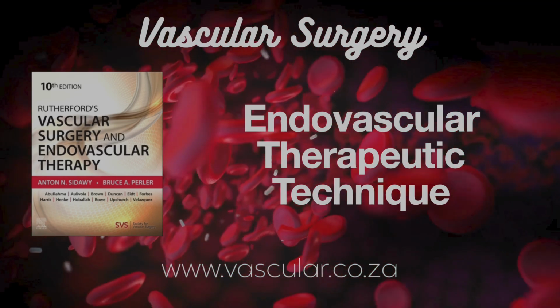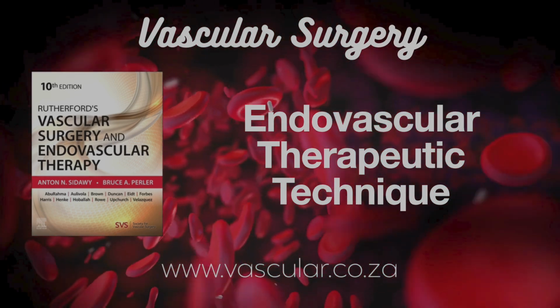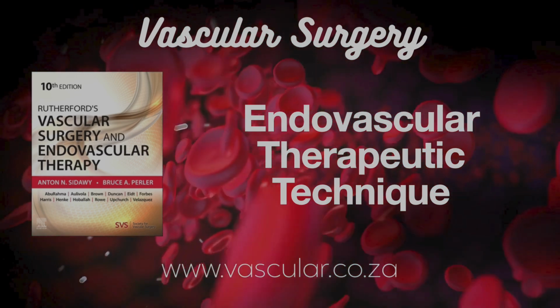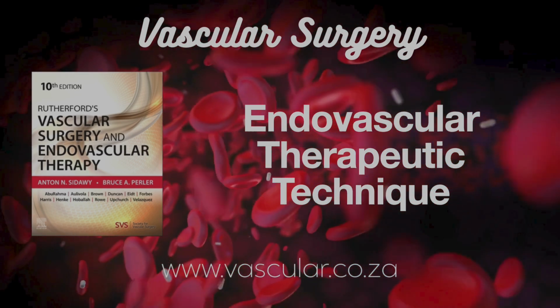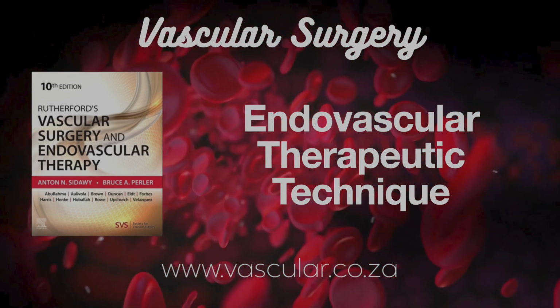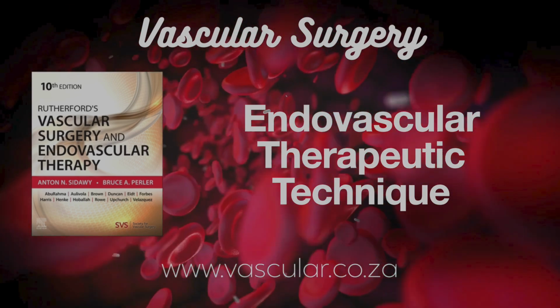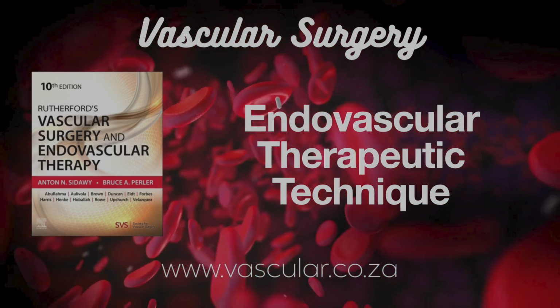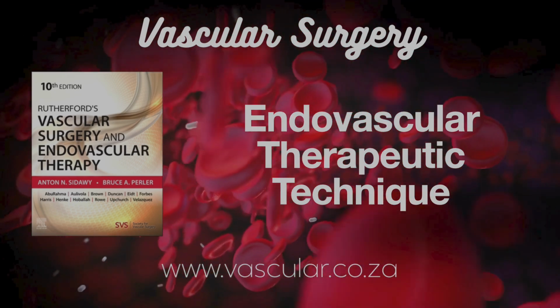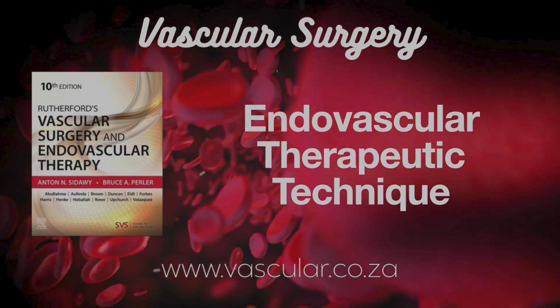But the source also mentions drug-coated balloons, DCBs. How do they fit in? Are they trying to avoid the stent? That's the idea. DCBs are a really innovative approach. They're designed to deliver medication directly onto the artery wall during that balloon inflation. What kind of medication? It's an anti-proliferative drug. The goal is to stop the smooth muscle cells from growing excessively, because that cell growth is a major reason arteries re-narrow after treatment. So it targets the healing response itself. Exactly. It's like a very localized, very targeted drug delivery system, aiming to reduce the need for that permanent metal scaffold. Interesting. Less foreign material left behind.